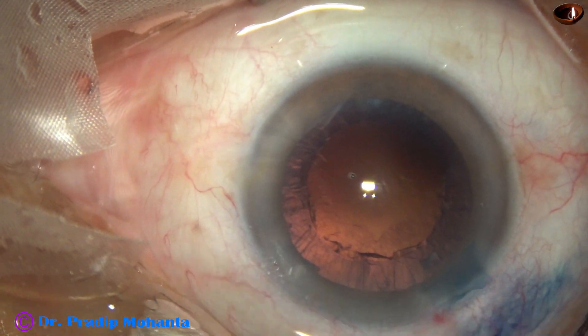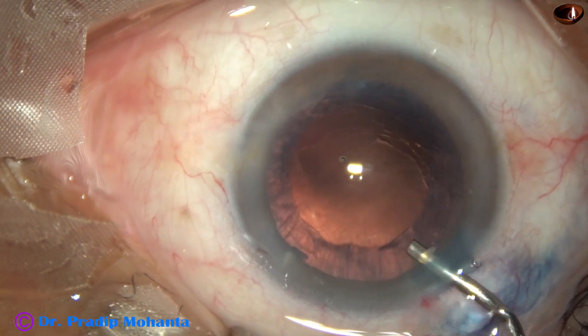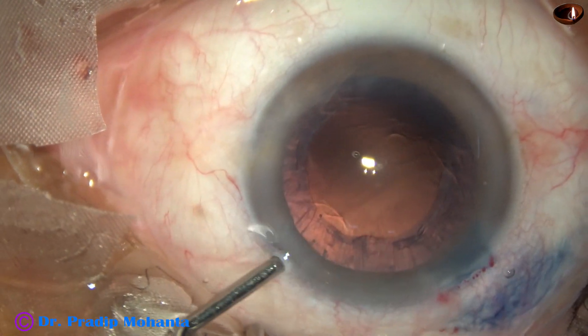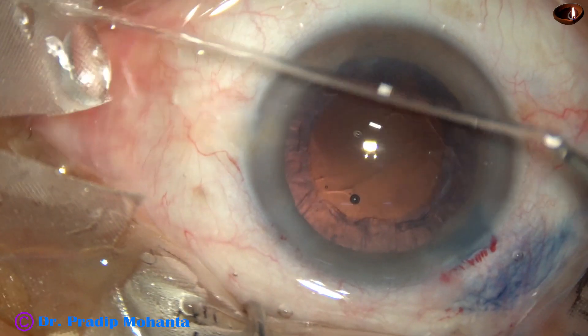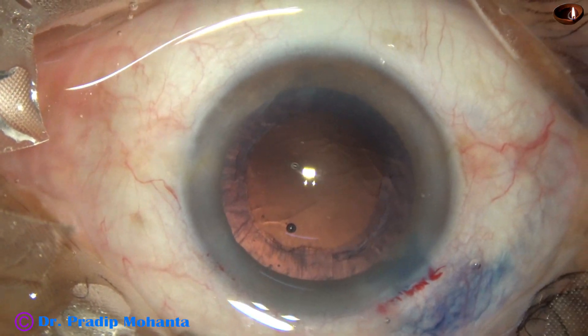Now some more viscoelastic is added, and then I am going to use this Simcoe cannula to remove the cortex.